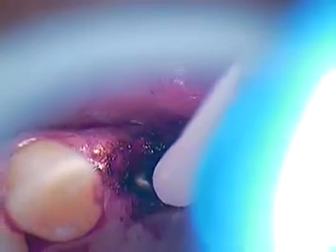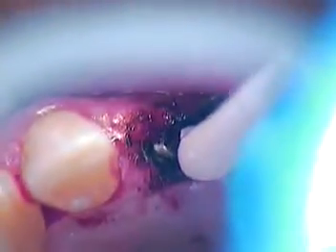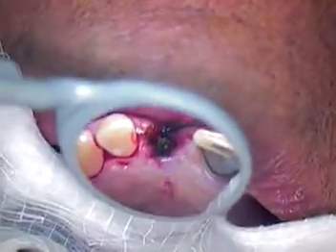And I'm going to go ahead and just use a little bit of wax, and we can just take that right out and keep that. That's a screw that was actually within the fixture itself. So now we've got to just basically control the site. We've got the screw out, controlling the site with any contaminants.